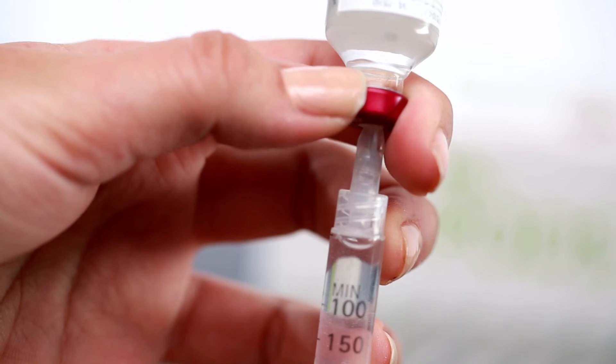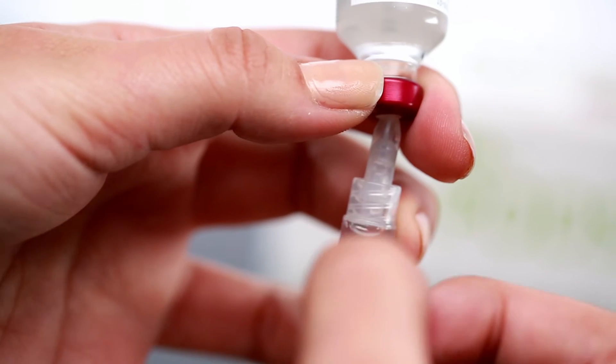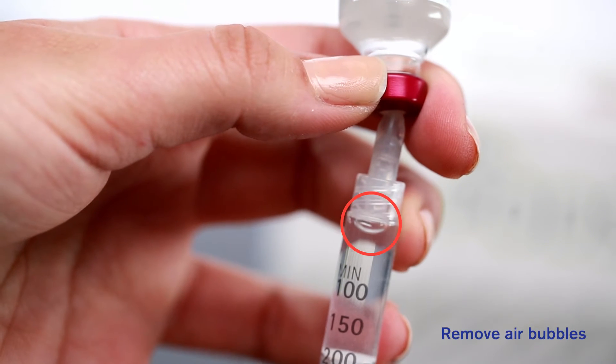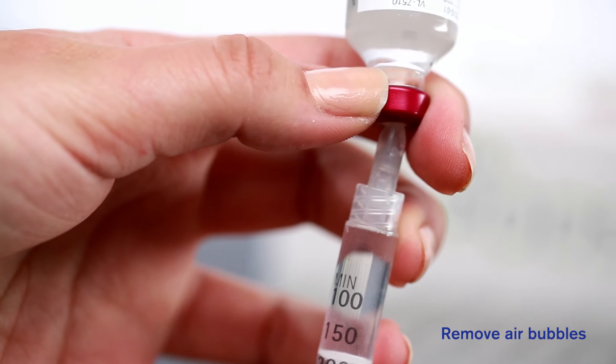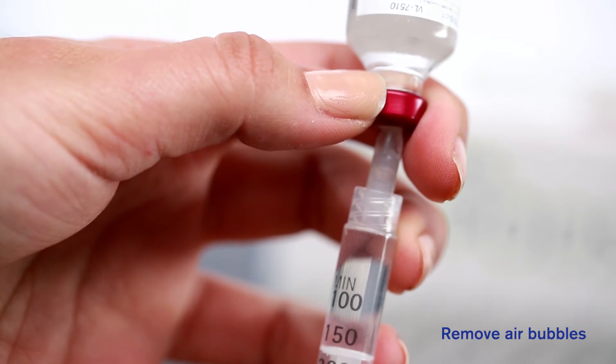To do this, point the needle upwards and tap the side of the syringe to move any air bubbles to the top. Now you can carefully push out any remaining air bubbles.